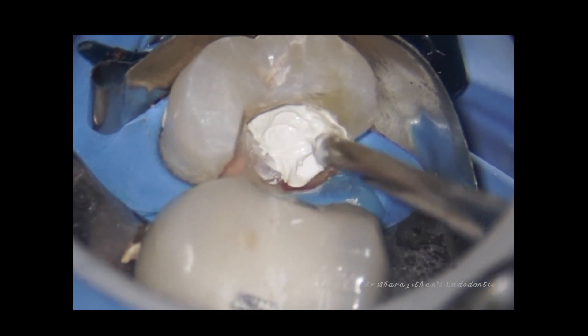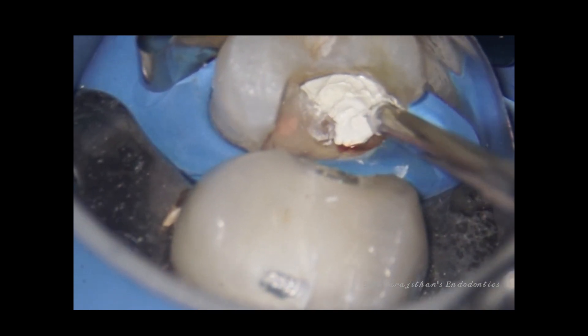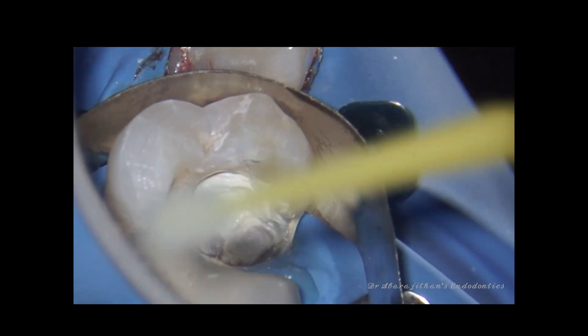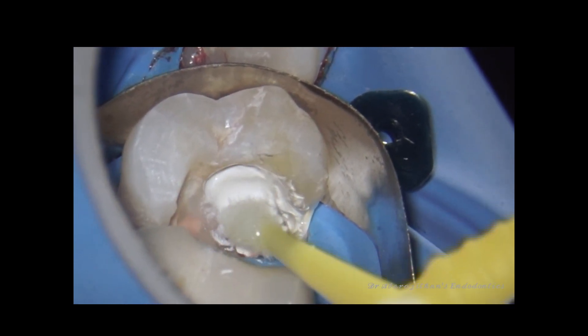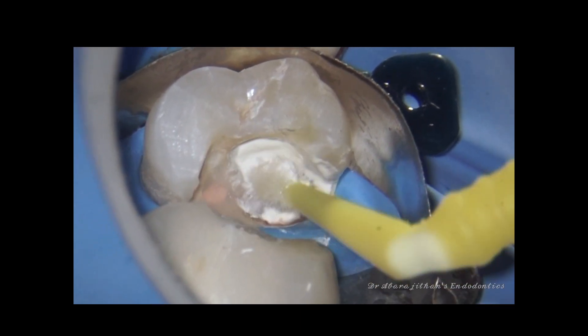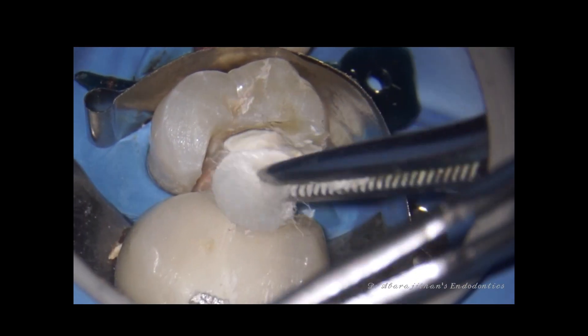I condense the material into the cavity. As I mentioned, I had taken more material than required — almost half of what I had taken would have been sufficient for this case. According to the manufacturer, the initial setting time is 15 minutes and the final setting time can take up to 60 to 120 minutes. From a clinician's point of view, the initial setting time is more than enough to proceed to the next step. For a perforation repair, you can leave it alone to set, or if moisture is low, you can additionally hydrate the cement using a moist applicator tip or place a moist cotton pellet over the perforation repair and wait 10 to 15 minutes.